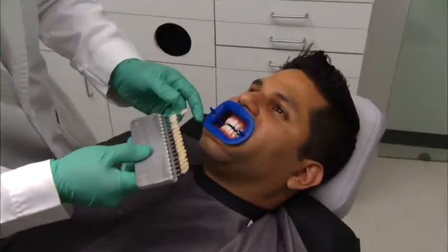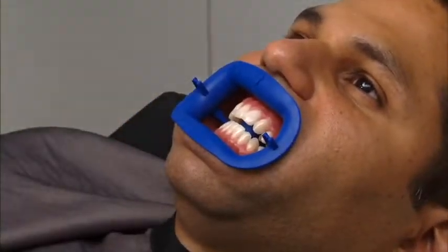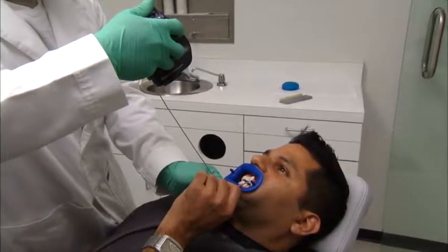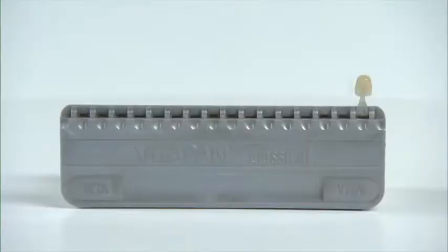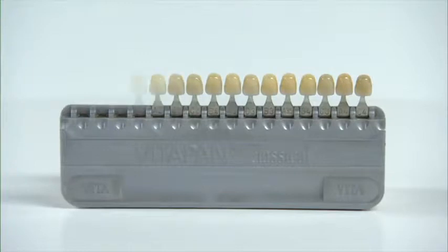Section 8. Post-treatment. Now it's time to assess the whitening results. Reinsert the retractor and take a retracted after photo with the lighter shade tab in place. Measure the shade change by counting the shade shift according to the value ordered shade guide.